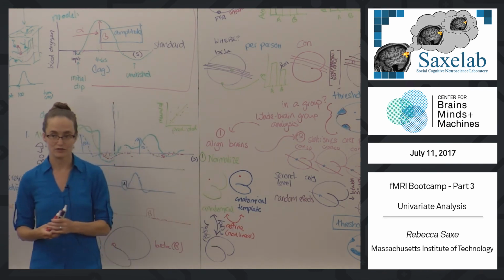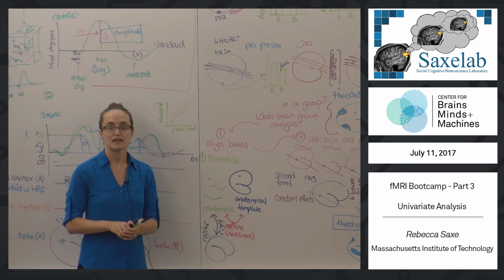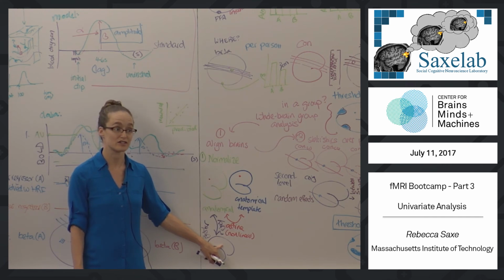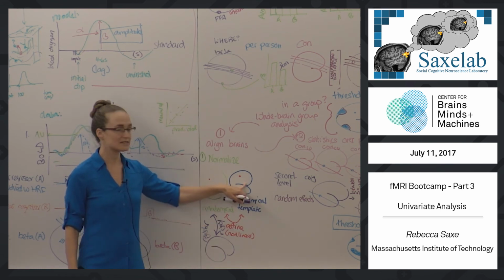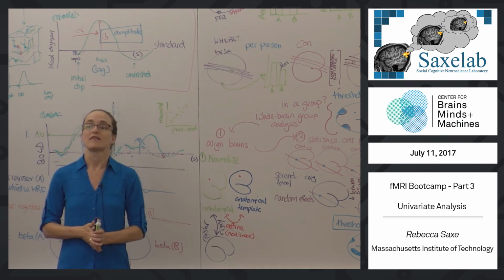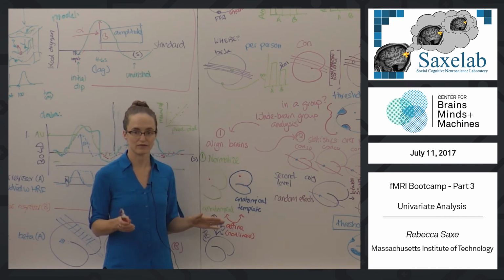Another thing that you can do, once you've got a pretty good alignment across people, is try to improve it by knowing something about the function of the voxels, by knowing how they respond to different conditions. That is what's sometimes called functional localization, which is to say, we'll trust this to get us close, but not perfect. And the reason is that we know for sure this process is not perfect. It definitely is not perfect.